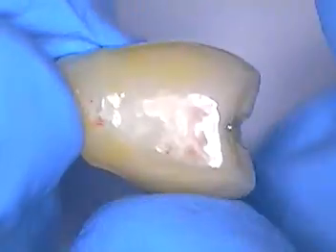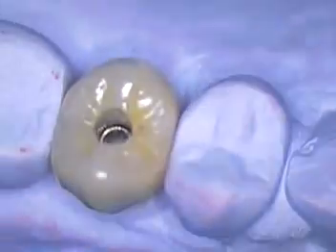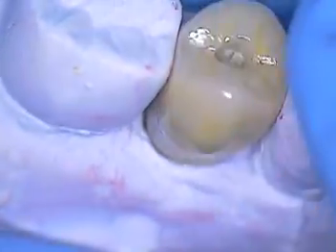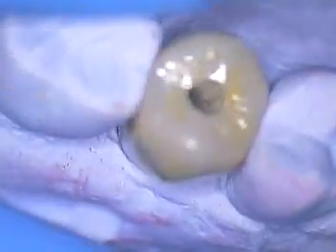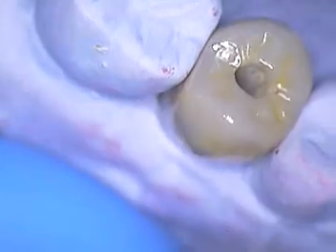We were checking contacts here — that's why they're in red — and I made one slight adjustment. Hopefully this will seat nice and passively and go in. Single tooth screw-retained dentistry for implants, trying to keep things simple and yet aesthetically pleasing.